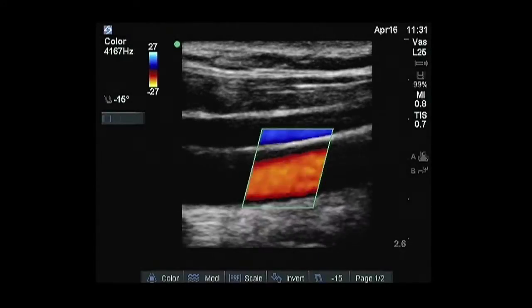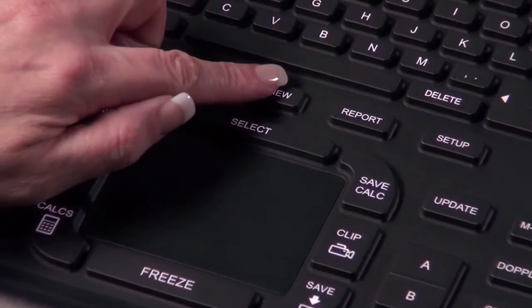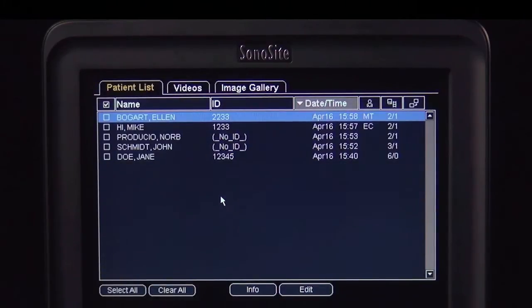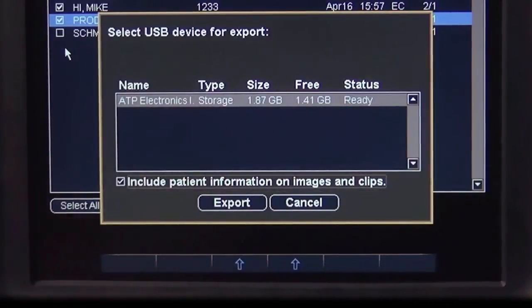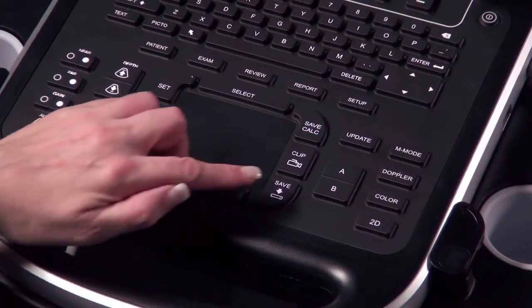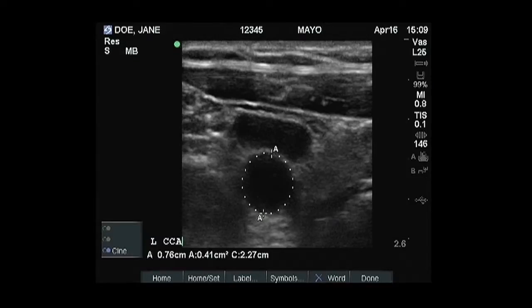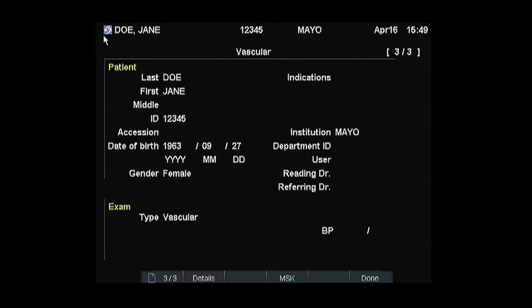This video will demonstrate how to save images and clips, recall these images for review, archive, or export images to a USB device. Images or clips of the ultrasound study may be obtained and saved to internal storage on the system. To save a frozen image, select the Save button. Images of the screen display or patient reports can be saved to print or export.